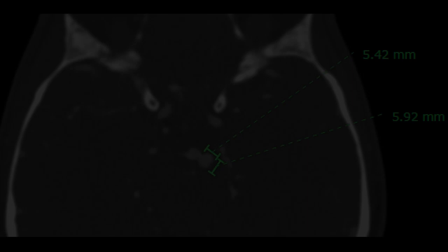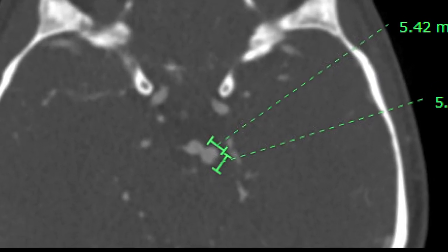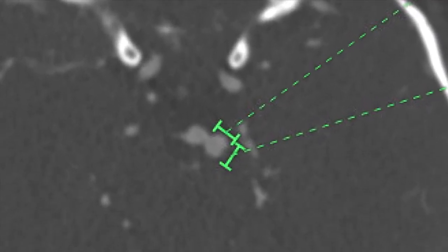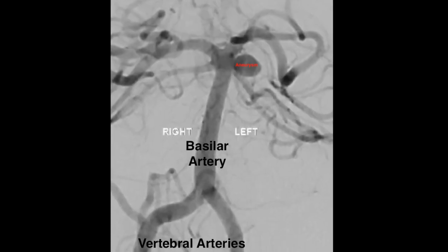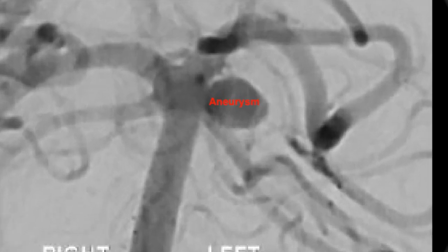She had double vision because her eyes didn't align appropriately, and she had an enlarged pupil and her eyelid was sagging. This is a CAT scan angiogram which shows her aneurysm, and it's rather circular, you see here. And then on the angiogram, you can see that it is truly like a ballooning out of a blood vessel, and I labeled it there with some red writing.